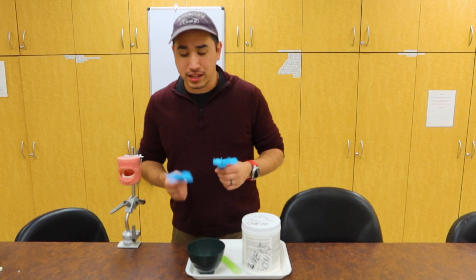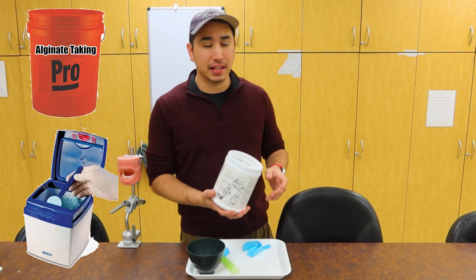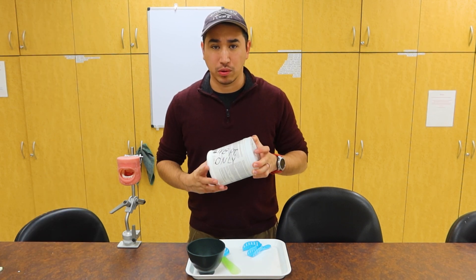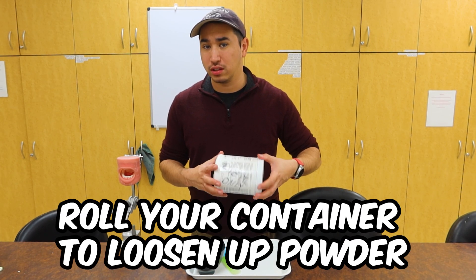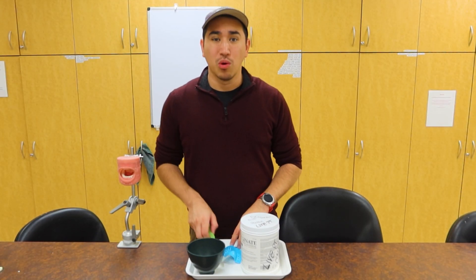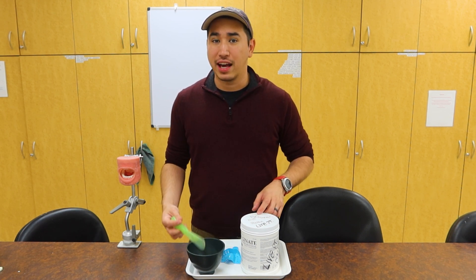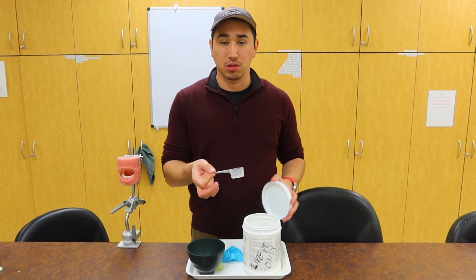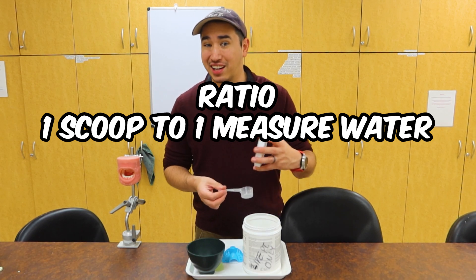Now that we have our impression trays, we need the main star of the game — our alginate impression material. It may come out of a bucket, a bin, a box, or a little canister like this. But always, whatever you're working with, try to fluff that powder so it's not condensed or packed in there — just roll your canister to make sure it gets loosened up nicely. Out in the field, a lot of assistants will eyeball the amount they need, sometimes using the spatula to scoop it out. Inside these little canisters are measuring scoops, which are important to keep and not throw away for proper powder-to-water ratios.